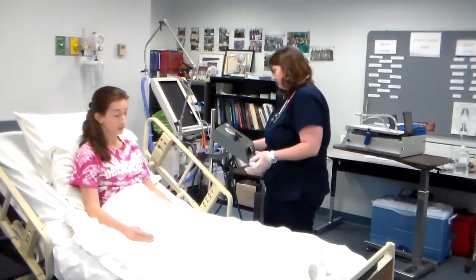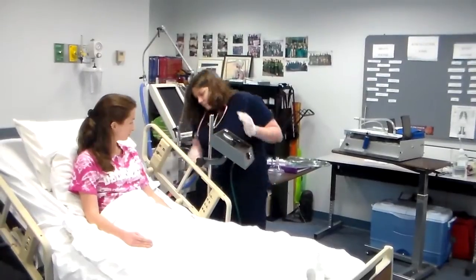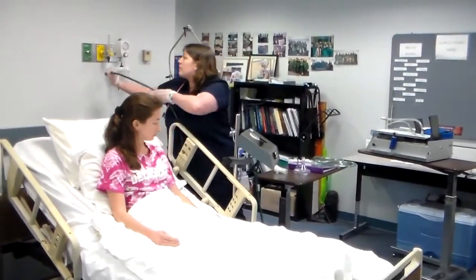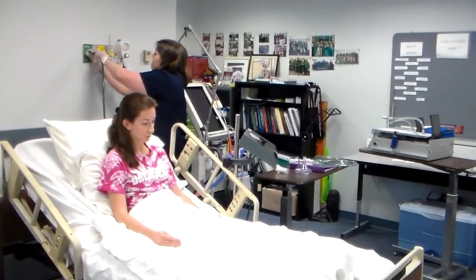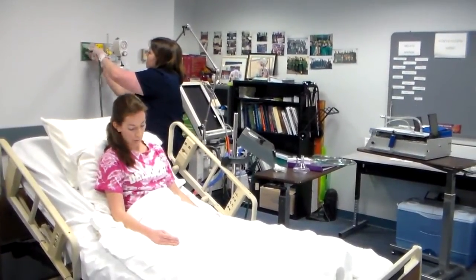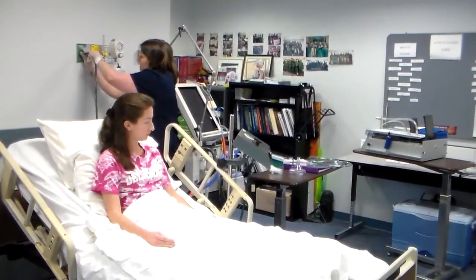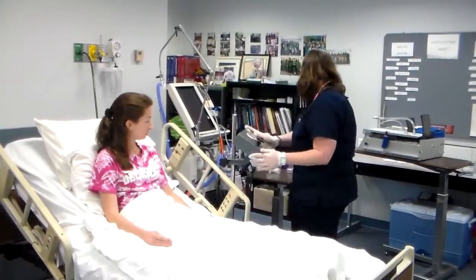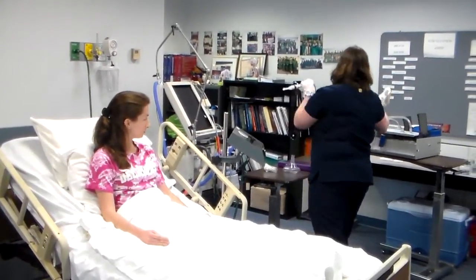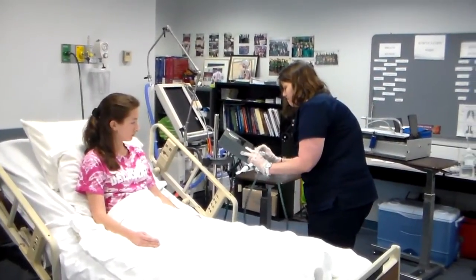Connect the Metaneb to the oxygen source. Then connect the circuit to the power box, making sure the circuit is properly locked into the power box.